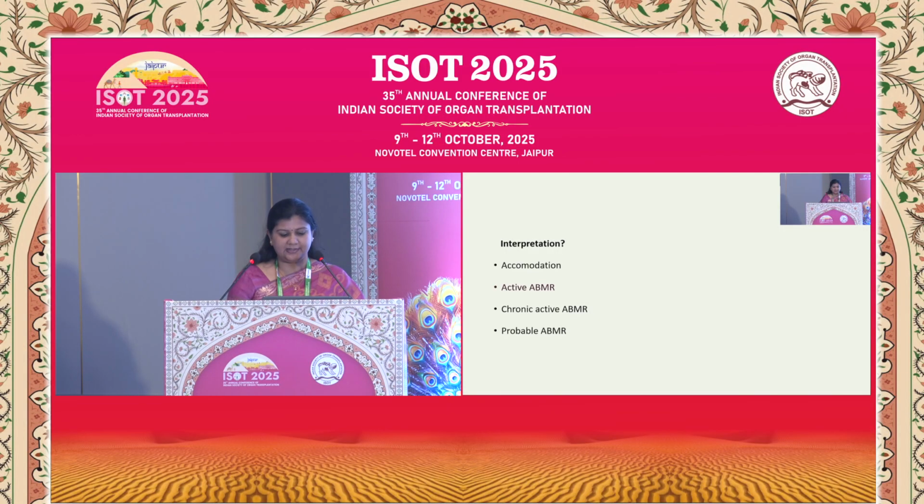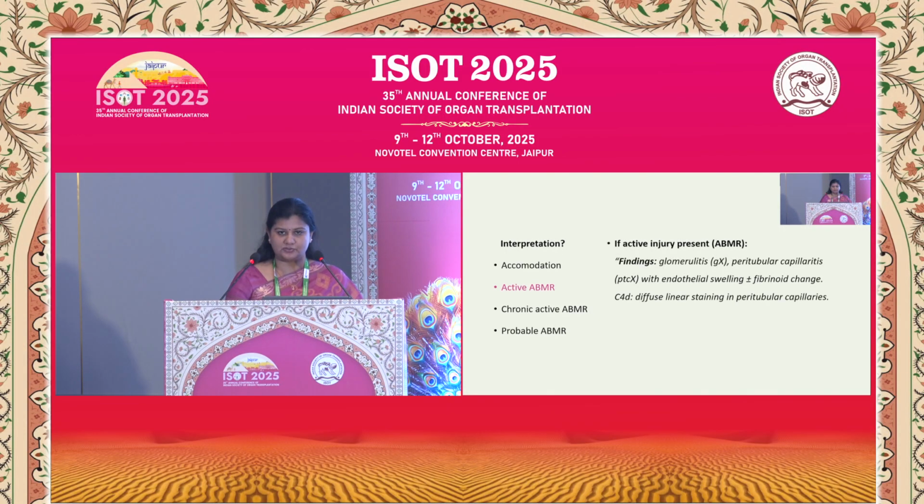Of course, it's a clear-cut case of active ABMR, because the biopsy shows features of microvascular injury along with C4D positivity. So nothing complex in that, it's a clear-cut case of ABMR. And in such cases, we have to correlate with DSA and other serology and clinical parameters.